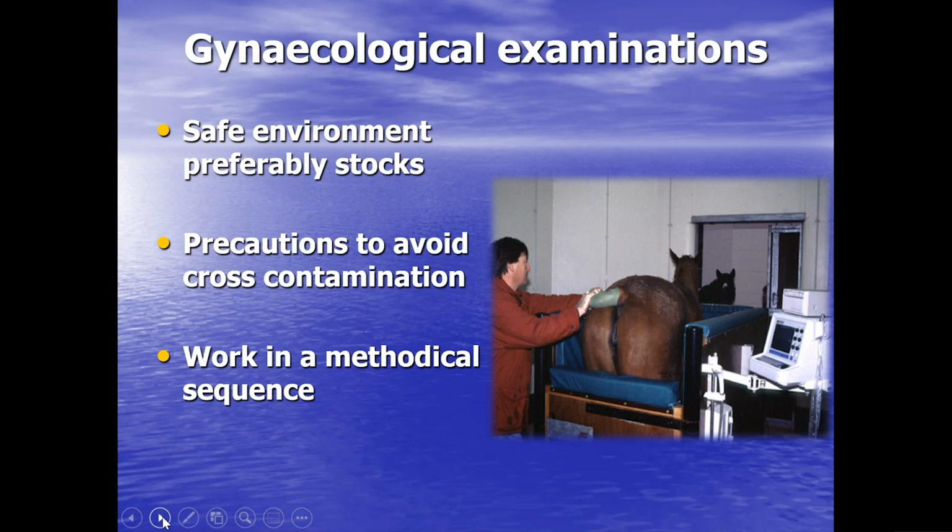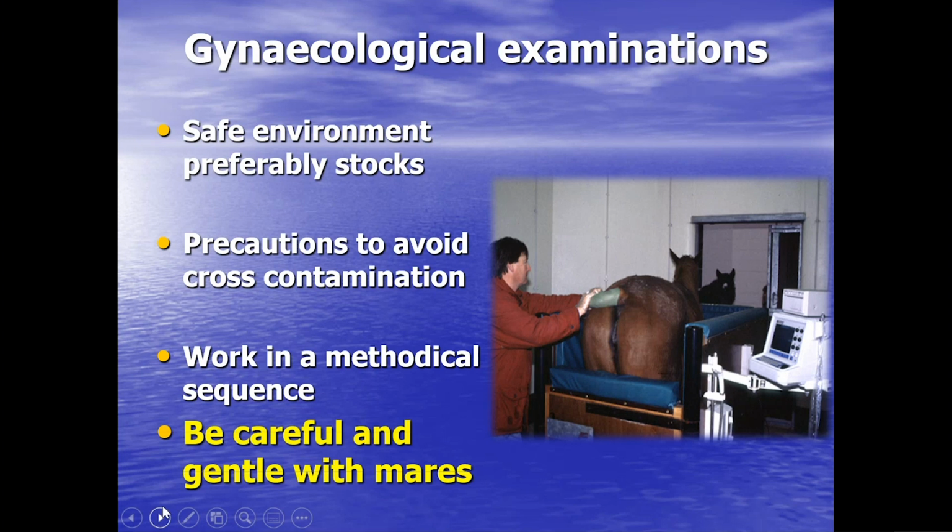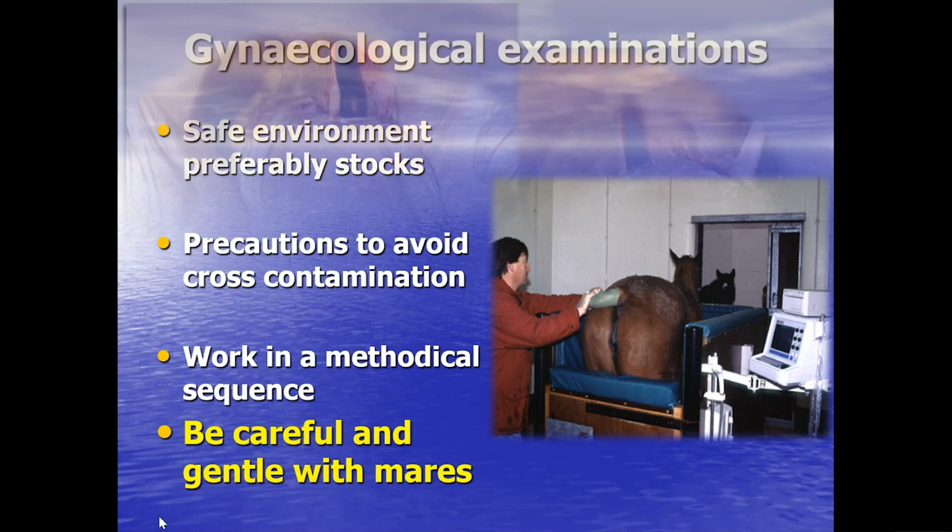That's really important in equine reproduction in general, mare gynecology in particular. Work in a methodical sequence, and never forget to be careful and gentle with the mares. You are doing an invasive procedure and it is possible to damage the mare. So it's important at all times that we are careful and gentle with the mares that we're working with.